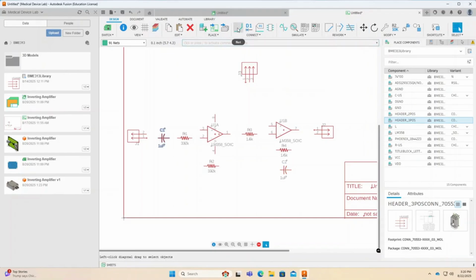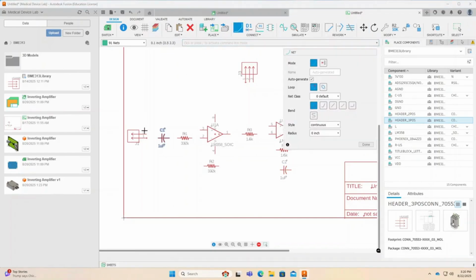Begin wiring by selecting Net and connecting all components. Connect pin 1 to C1. Connect C1 to R1. Connect R1 to the inverting input of U1. Connect R1 to R2. Connect R2 to the output of U1. Connect R3 to the output of U1. Connect R3 to the inverting input of U2.